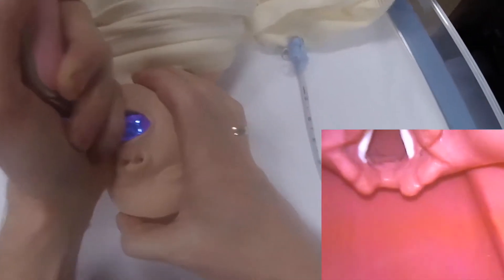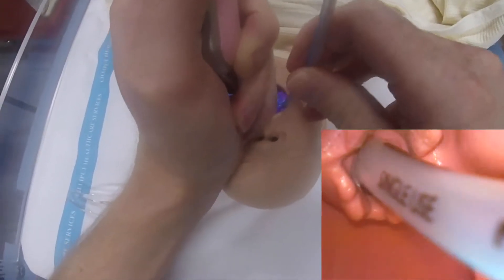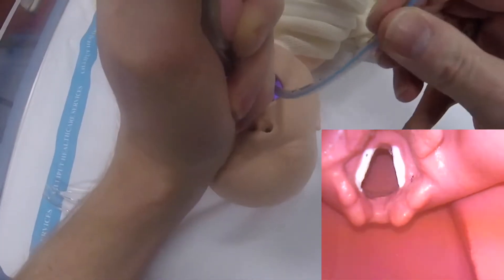One of the nice things about this laryngoscope is that it also works for direct vision. I'm going to do this intubation just looking down the blade without looking at the screen, and it works fairly well for that too.